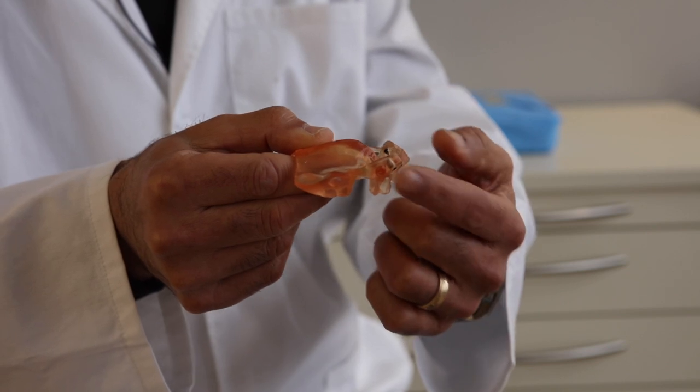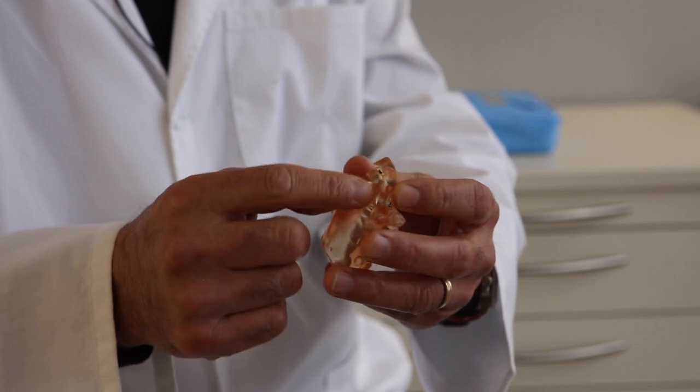Once you've made your pilot holes for your stabilization pins, you can place the actual surgical guide into your patient's mouth. Insert the stabilization pins into the osteotomies you piloted with your initial guide. Once this is locked in place, you can make your initial osteotomies for your implants using the smallest bur you have available, just to get a reference of where you're going through the hard tissue.